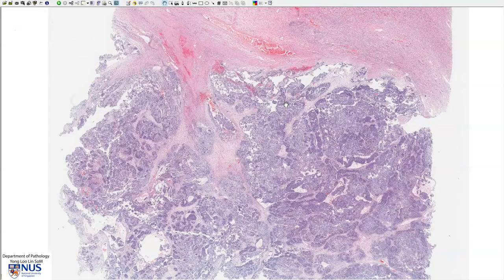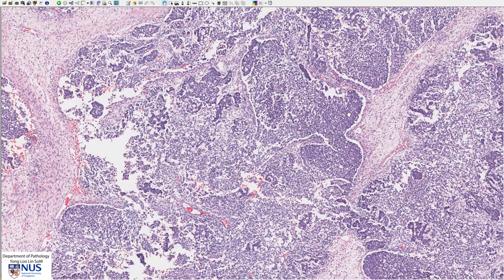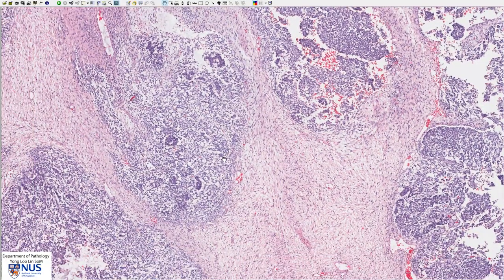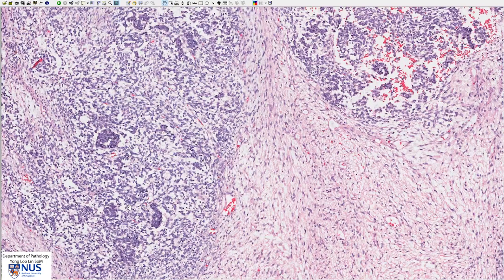In summary, this is an example of a nephroblastoma of the kidney or a Wilms tumor, which is a pediatric tumor. It is malignant but has a good prognosis, and it is very often a triphasic tumor composed of: undifferentiated blastemal tissue, which looks like small round blue cells with lots of mitotic figures; epithelial tissue, which forms tubules; and the stromal component, which is composed of spindle cells. Thank you.